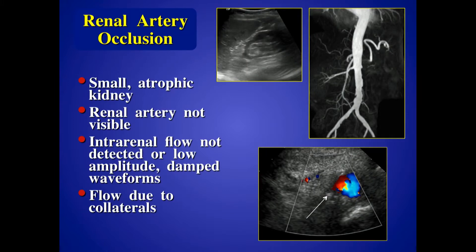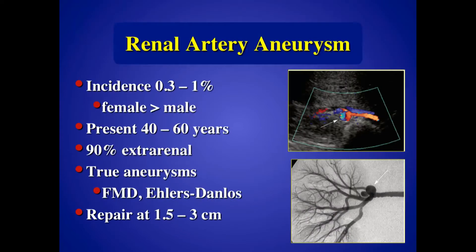There are lots of other things we see incidentally in the kidneys — aneurysms, occlusion, pseudo-aneurysms, and tumors. Here's a patient with a renal artery occlusion — the kidney is small and atrophic, barely any parenchyma surrounding the echogenic hilum. We just see a nubbin at the origin of the right renal artery — you don't see the artery at all, correlating very well with the MRA. You may see flow inside the kidney, but if you do see flow inside a kidney with an occluded artery, it's typically very abnormal — very low velocity and a very rounded appearance because the flow is coming in via collaterals. Here's an example of a renal artery aneurysm with angiographic correlation — not very common but you'll see them once in a while. They occur more often in women than men, typically middle age, with 90% extra renal.